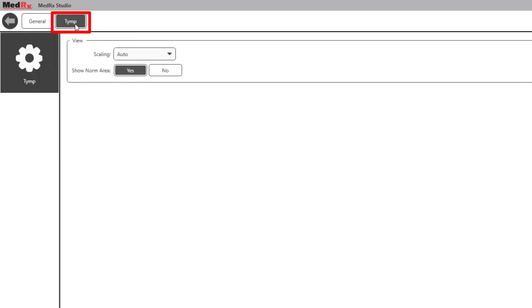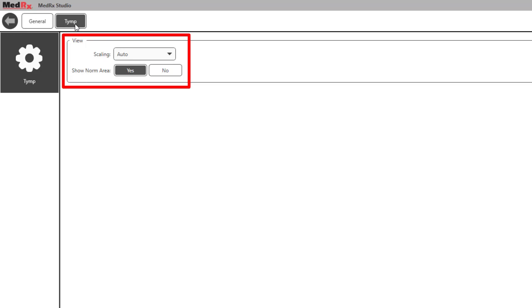Select the tymp tab. The tymp tab allows you to change your view options. These include scaling to adjust the graph size as well as showing the normal tymp range.